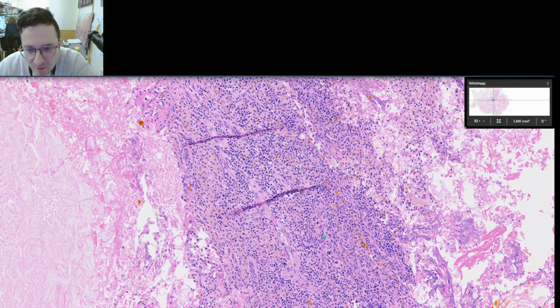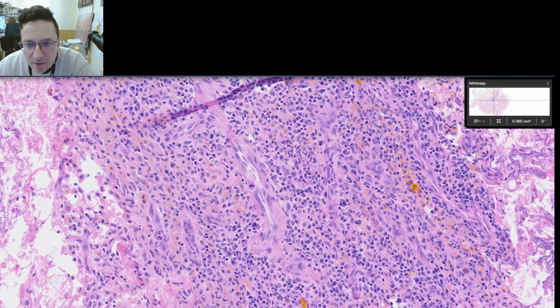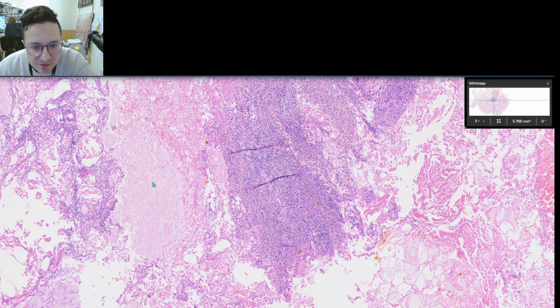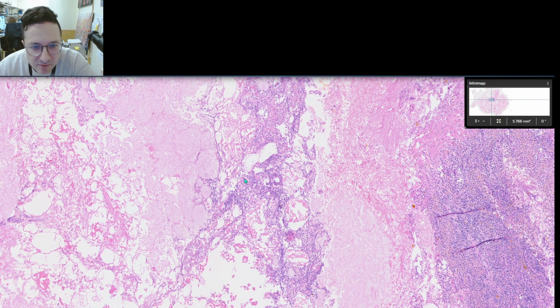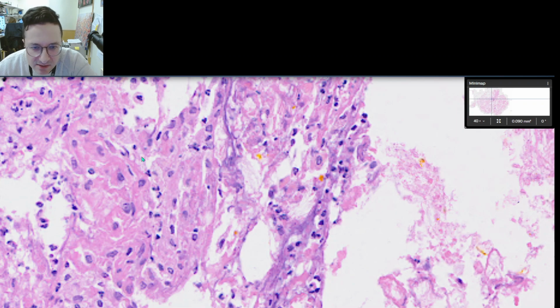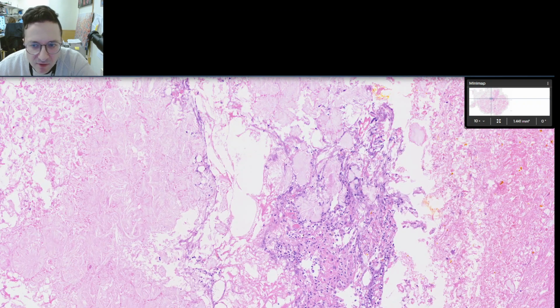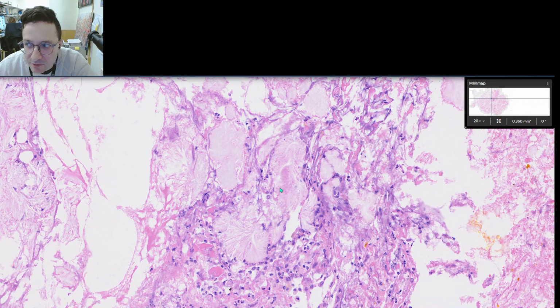Here could be, again, a lot of hematoidin, a ton of acute and chronic inflammation, a ton of plasma cells, and some vessels, almost like granulation tissue. And again, here you have saponification and fat necrosis. So again, this was signed out as descriptive and consistent with acute pancreatitis. This is nice for saponification and fat necrosis.